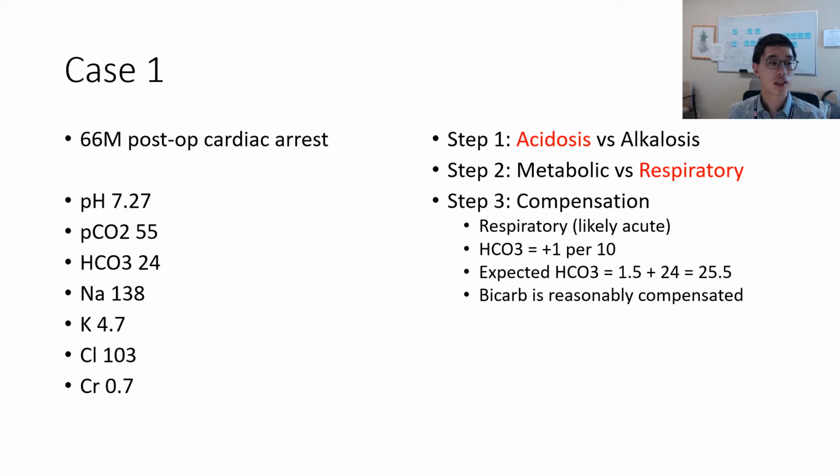And here we can see that the bicarbonate is reasonably compensated. 24 is close enough to 25.5. Okay. So for right now, we have an acute respiratory acidosis.